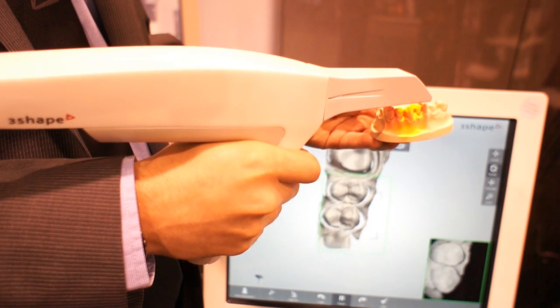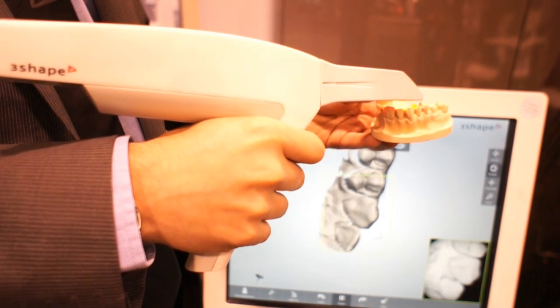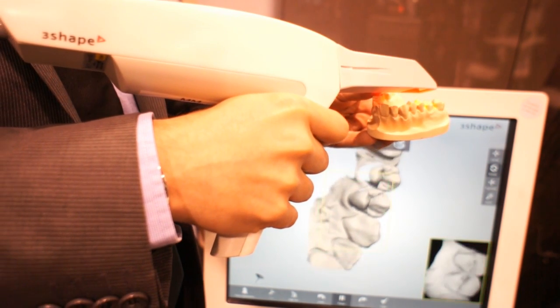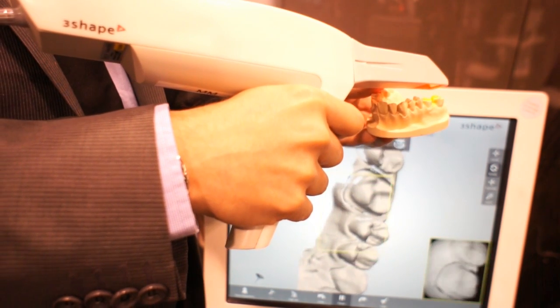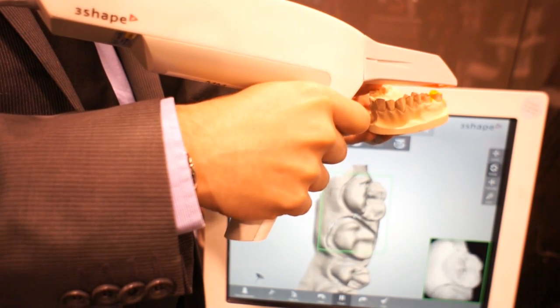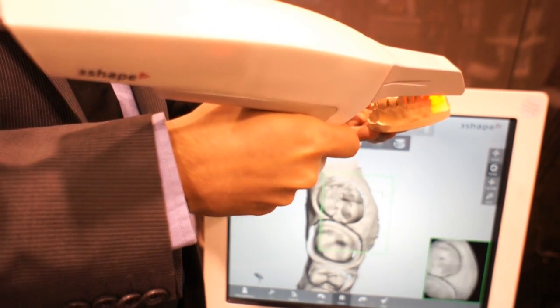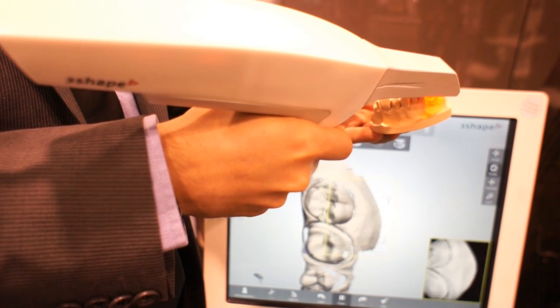We can hear the ticking sounds — what does that mean? The ticking sound is to verify to the dentist that he is doing good, that the device is capturing images. So I'm not looking at the screen right now. This is just to make it easier for the dentist so he can focus on his patient's mouth.